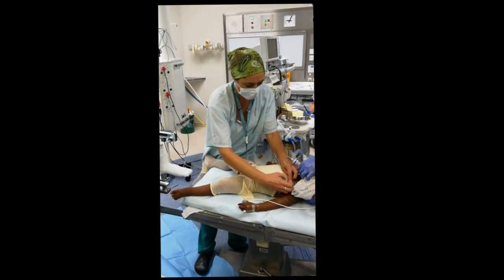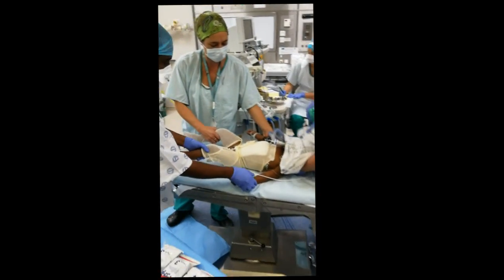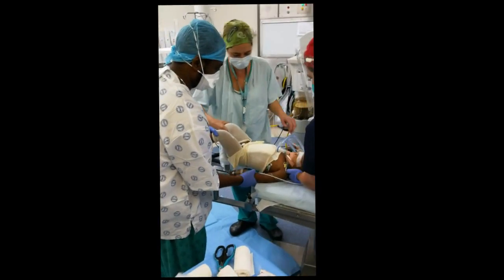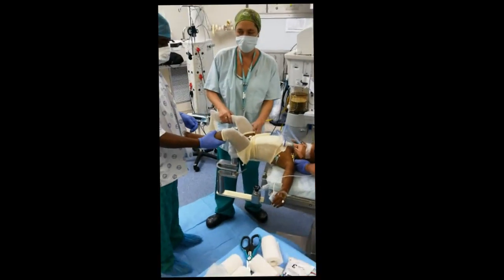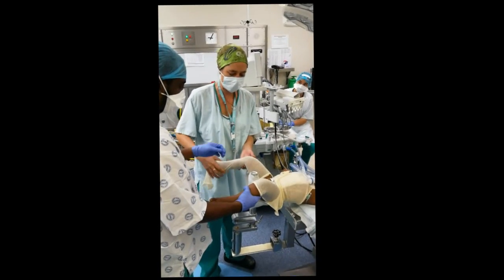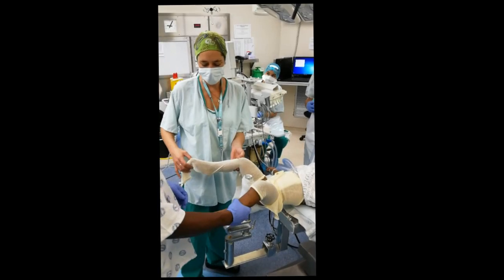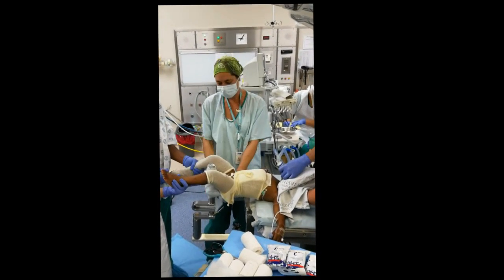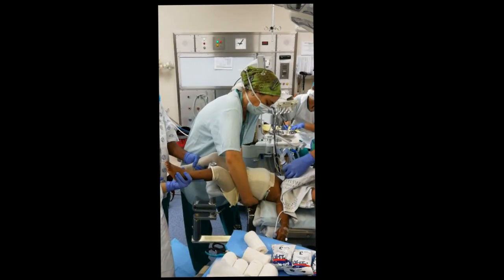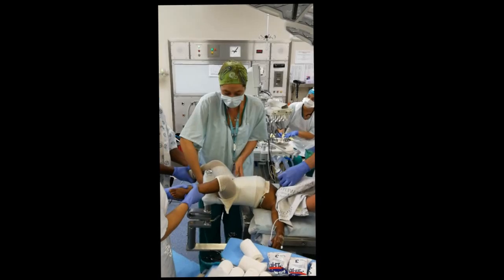Now once you've done all this prep, you can move the patient down onto the spica table. With assistants to hold the airway, make sure everyone is ready, and bring the patient all the way down. The position of immobilization is 60 degrees flexion and 30 to 40 degrees abduction, with the knee at 90 degrees. Make sure you have your rotation right — the hip, the knee, and the ankle need to align well, as rotation doesn't remodel well in this cast. Make sure you can correct any rotational issues. You can already see we're using abduction, but it's important to keep an eye on that.